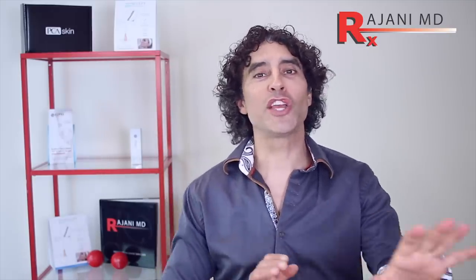Hi, I'm Dr. Ajani. I'm going to take you through a combination treatment today involving the new Barb 4 PDO thread. Let's go to the treatment.